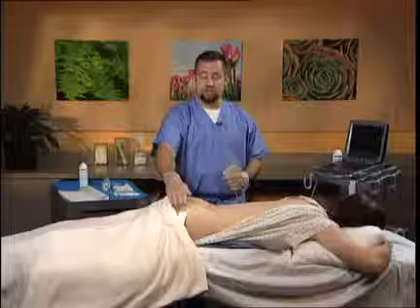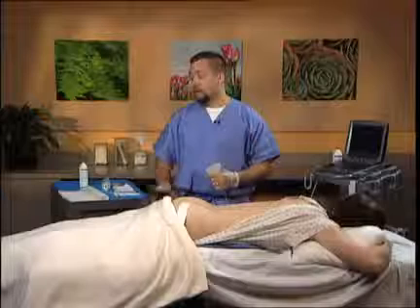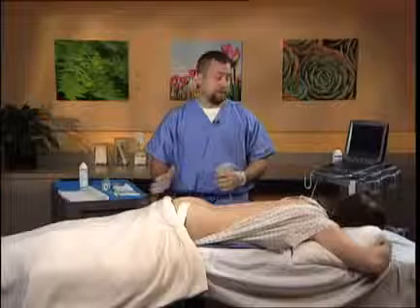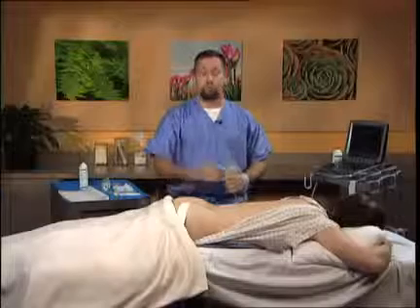In this particular case, you can see that the gluteal folds have been taped down and away in a caudal fashion to the patient. We now have a clean access point within the two gluteal folds.